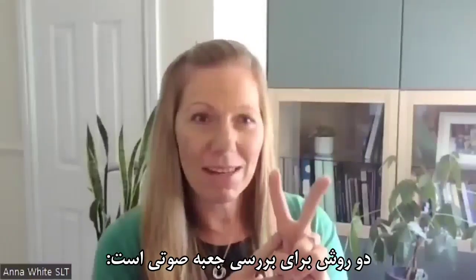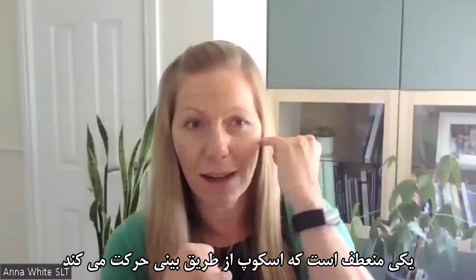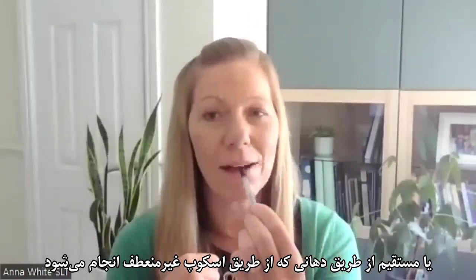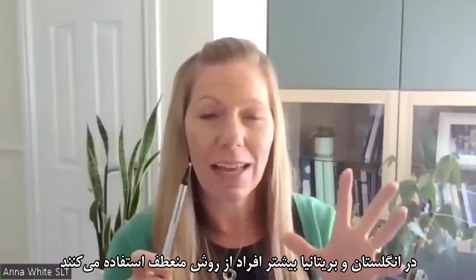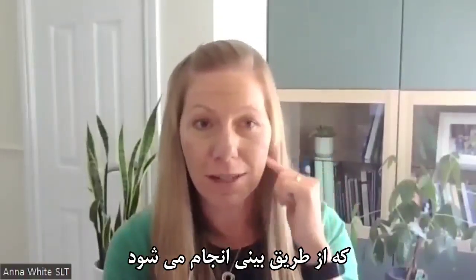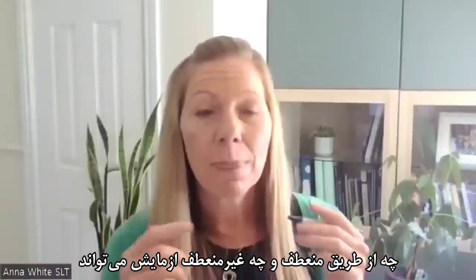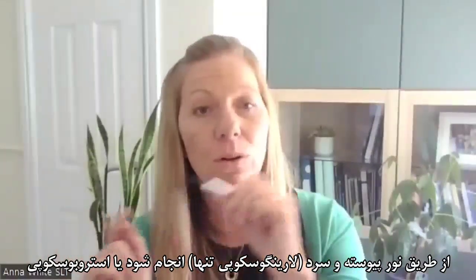There are two ways of examining the voice box: either through a flexible scope that goes through the floor of the nose and round, or directly through the mouth using a rigid scope. In the UK, most people will use the flexible, so it goes through the nose. But whether you do the flexible or the rigid, it can be either a continuous light, cold light, or stroboscopy.